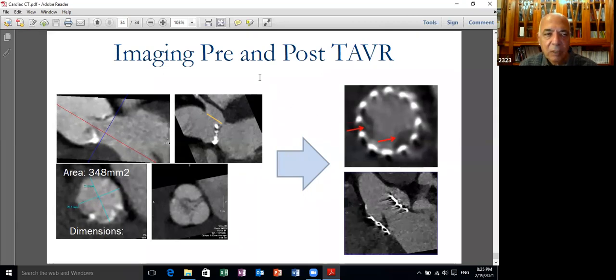So as you see here, it's very valuable in detecting coronary calcium in asymptomatic patients, detecting the extent of coronary stenosis in acute and chronic conditions, and in extracardiac conditions. So I stop at this stage and get your questions if you like. I hope Ahmed Shahata is with us because he will be able to answer many of the technical questions. He has been working in that field for a long time and became an important expert in this field.